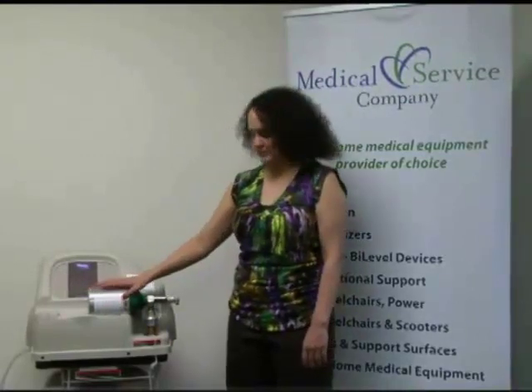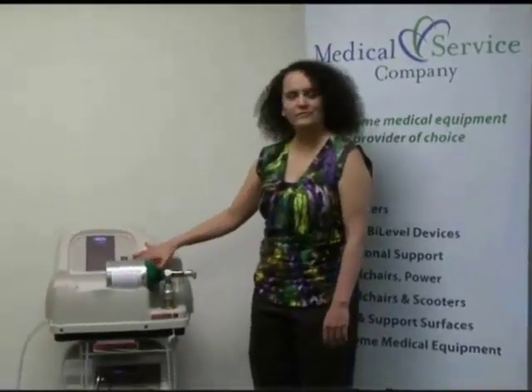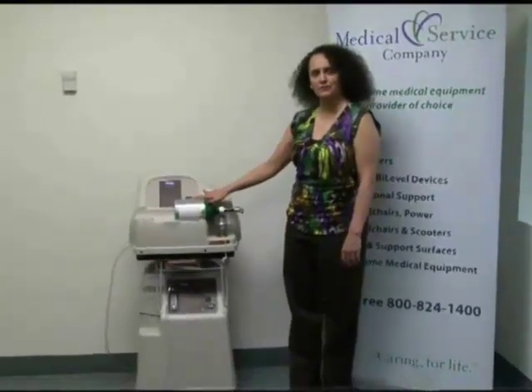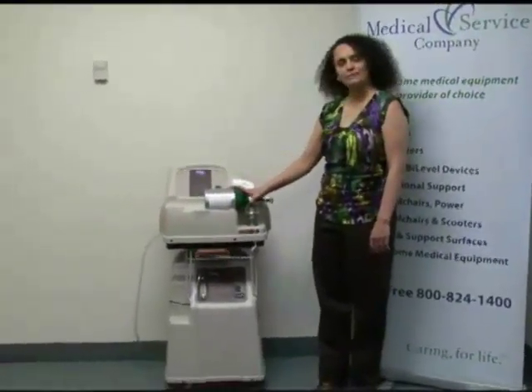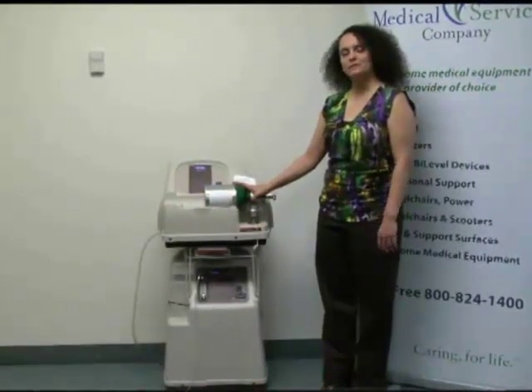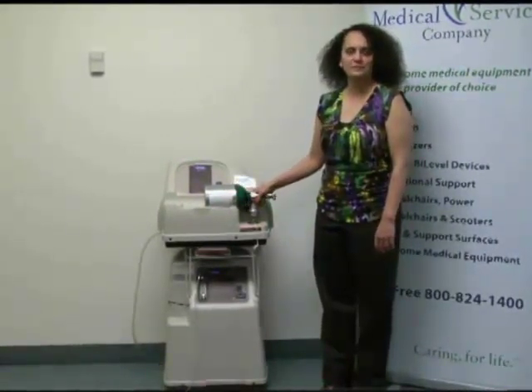I'm Bill Jo with Medical Service Company. I'm a respiratory therapist and I'm here today to show you how to use the home fill system. This is the part that goes with your oxygen concentrator. It's designed to refill tanks so that you can refill them on your own. That helps a lot with not having to wait on drivers to deliver tanks.